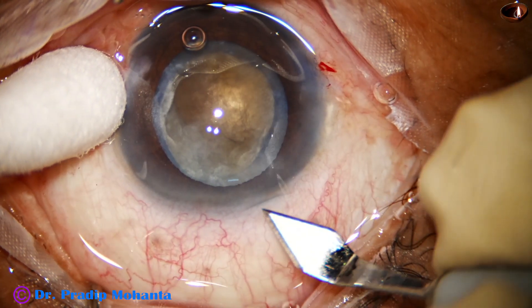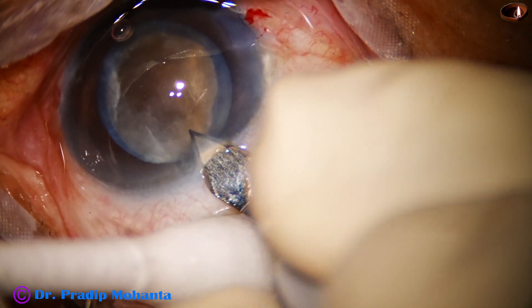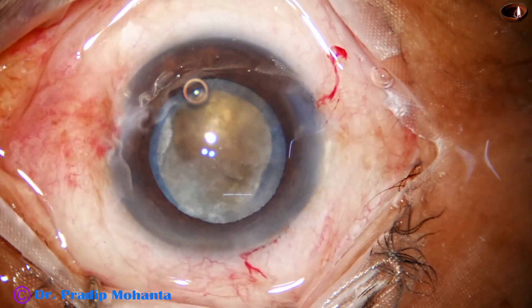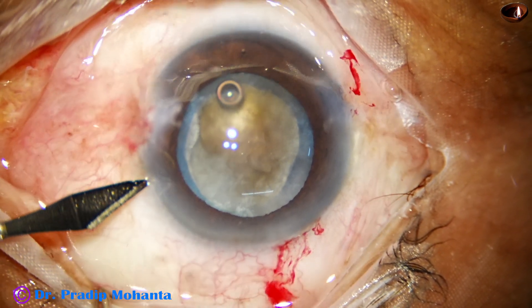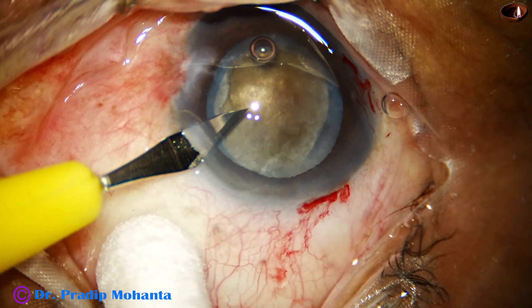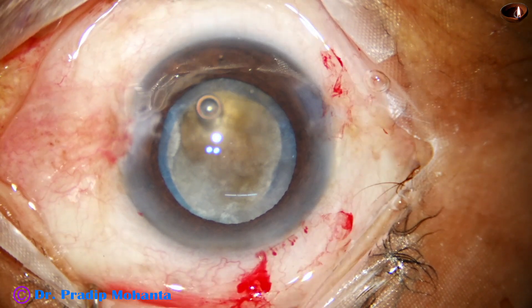The patient is one-eyed, so I was a little apprehensive about doing FACO. Now I do the main incision, enlarge it a little bit, and then do a side port. Then I am ready to go into the anterior chamber with the FACO needle.